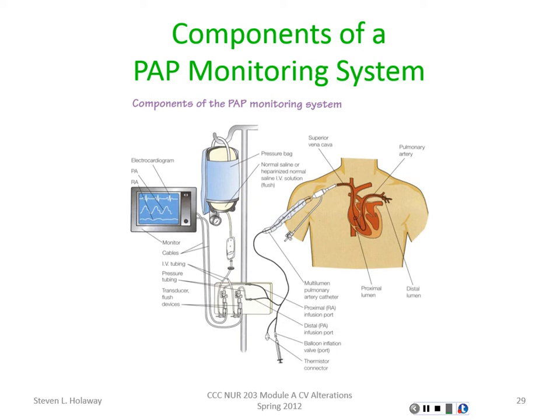One of the critical care units at CCU actually has this big pump. You can run like 5 different fluids through it at one time if they're compatible. So those would actually go into that. We actually use what we call the manifold, and you'll see that on the guy in anesthesia inserting. It's a piece of plastic this long that has stopcocks on it, so you can put different fluids in it and manage the different fluids from there.